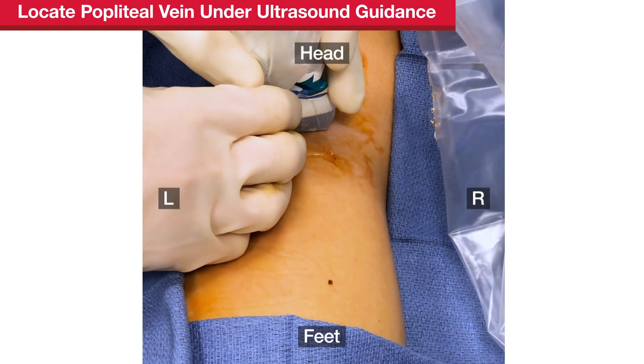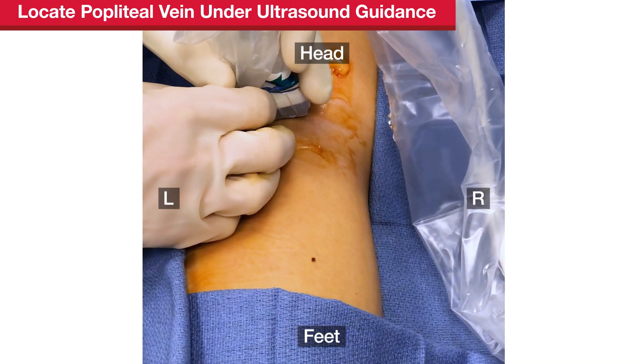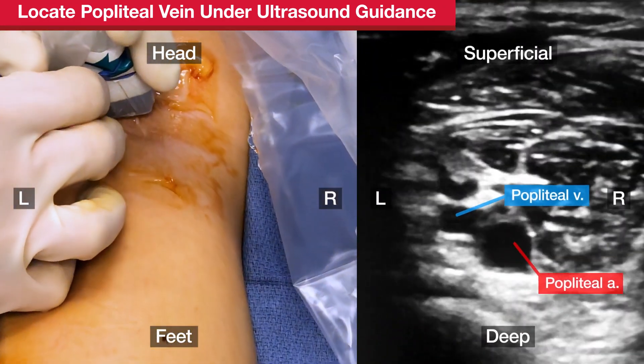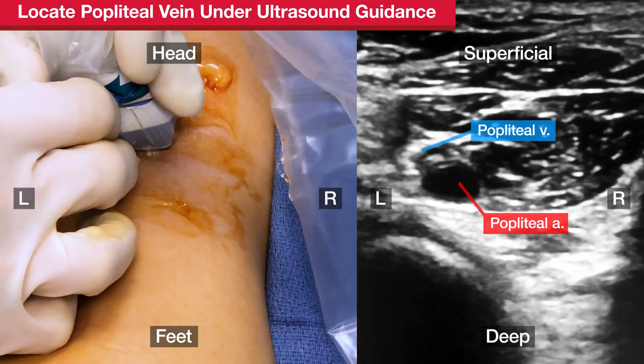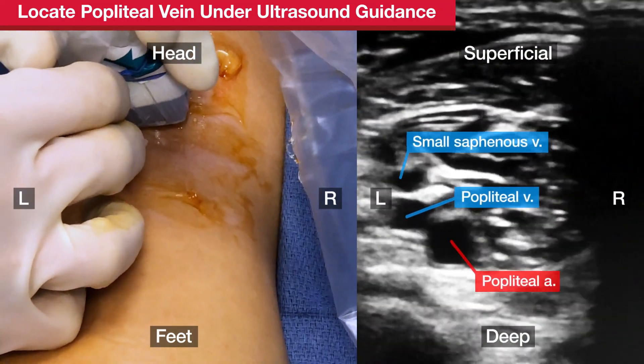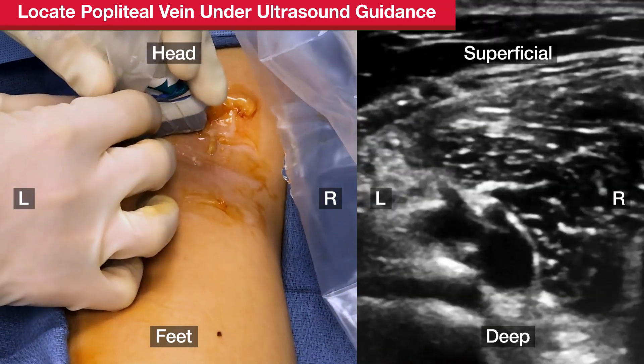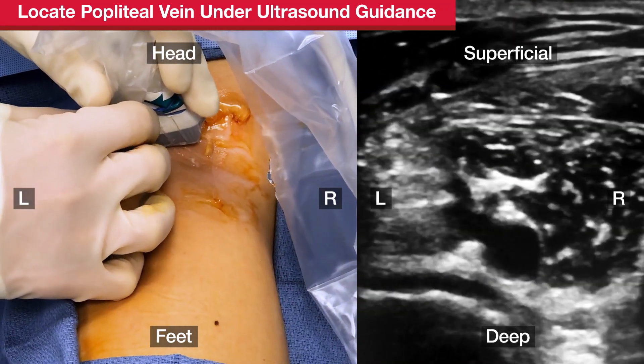Using a sterile ultrasound transducer, look for the vein in the popliteal fossa. The vein will be more compressible than the artery, which is visibly pulsatile. Distally, the small saphenous vein can also be seen on ultrasound. Apply mild pressure from the transducer to distinguish the compressible vein from the artery.